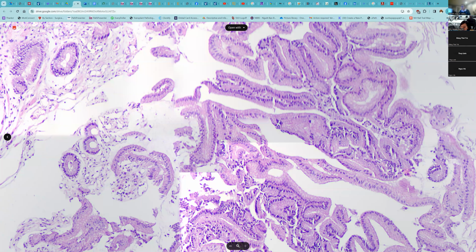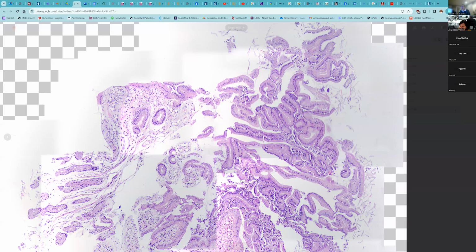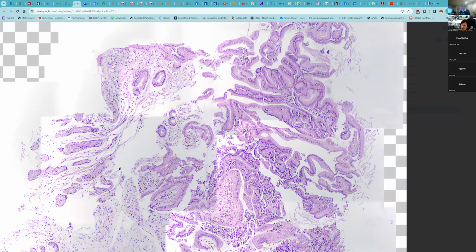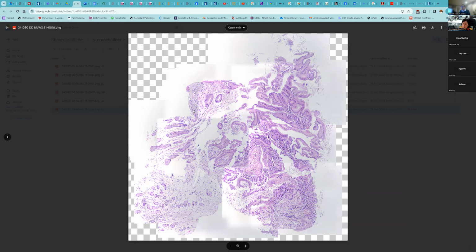We have basal nuclei, and we have a lot of cytoplasm. It kind of looks a little bit distorted. The architecture is disrupted. But I think there's the sense that this is part of maybe a polyp. We see the pinch mark here and maybe here from the biopsy process.